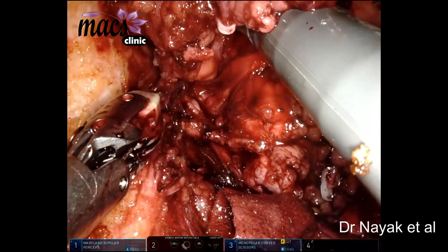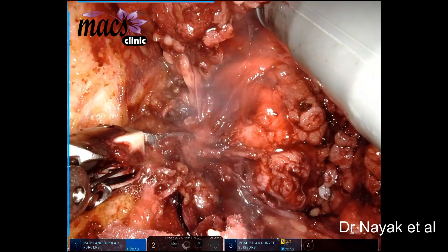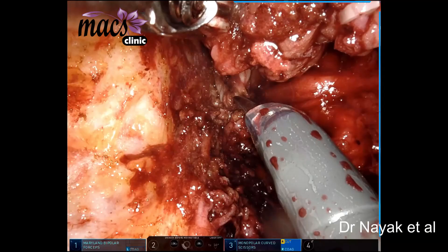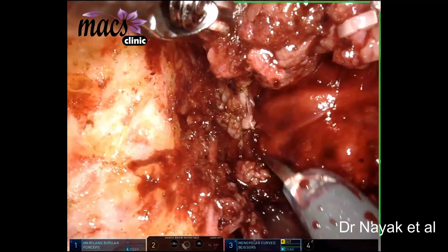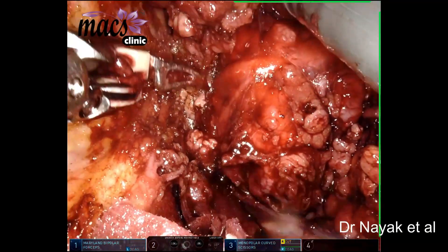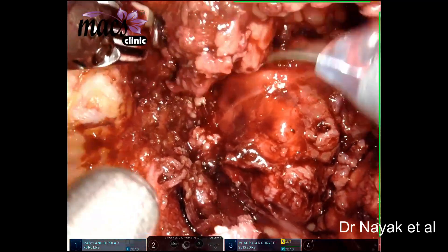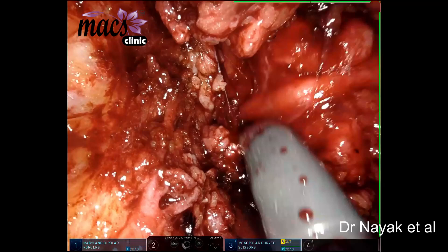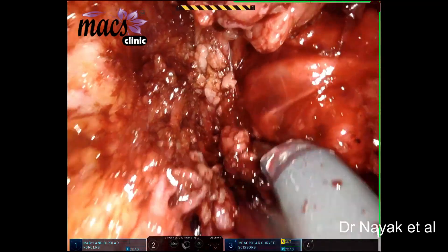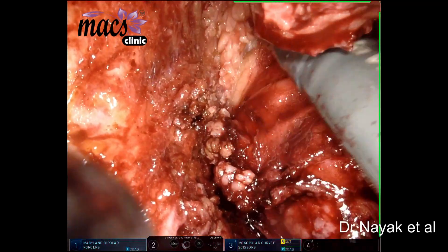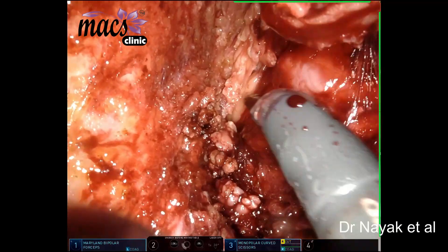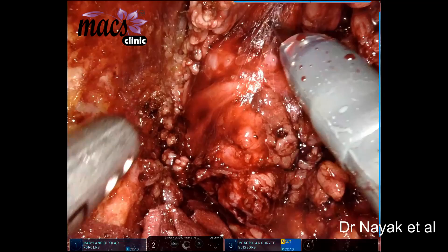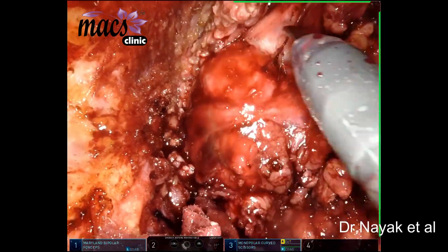As we are planning to perform a total parotidectomy — a nerve-sparing total parotidectomy — we are performing a superficial parotidectomy here. As we perform total parotidectomy, we have to remove the superficial lobe and the deep lobe separately. That is the superficial lobe which is separated.